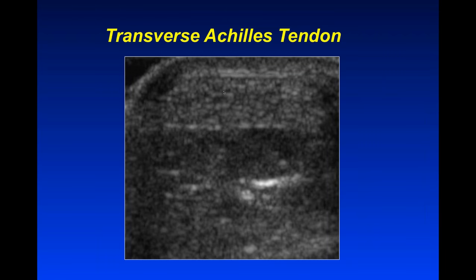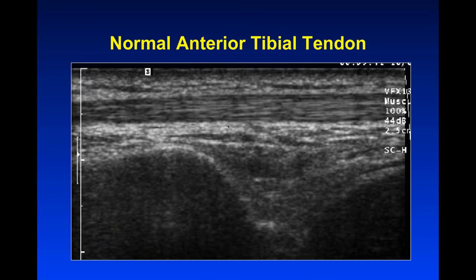When you go transversely on a tendon, it will have what we call the brush pattern — almost like cutting a fiber optic cable in cross-section. Where you see fibers in longitudinal, cutting them in cross-section gives you bright and dark dots coming toward you. This is demonstrated here with a cross-section of a normal Achilles tendon and an anterior tibial tendon, again showing that fibrillar pattern. The point is that tendons have this signature, so when you see it, you know that's a tendon.